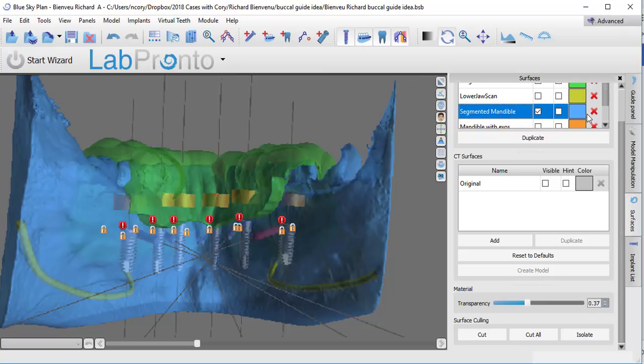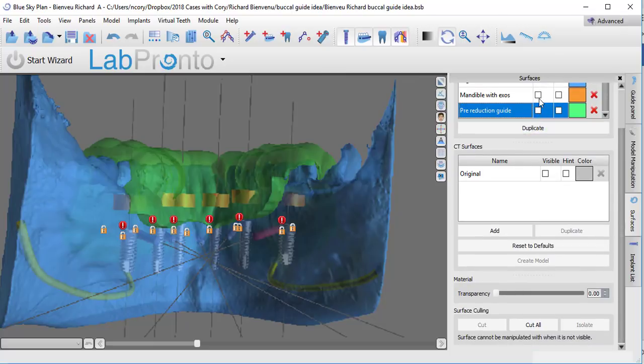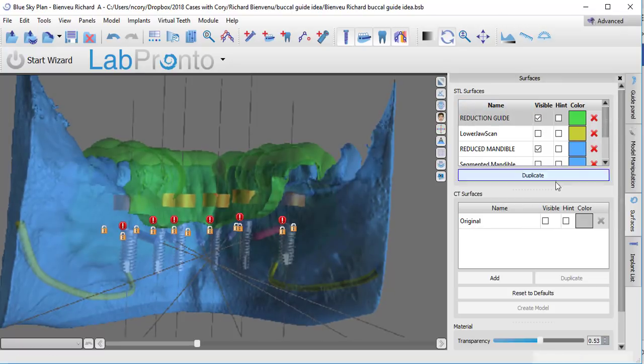Now I do like to duplicate this segmented mandible because I always like to keep one version which remains untouched, and then the other we can turn into the reduced mandible. So I'm going to turn that one off, and this one I'm going to go ahead and rename as the reduced mandible. Okay. So the two models that you have visible on the screen, in this case the surgical guide, which I'm going to rename as reduction guide, and the reduced mandible, those are the only two files that I have visible on the screen.